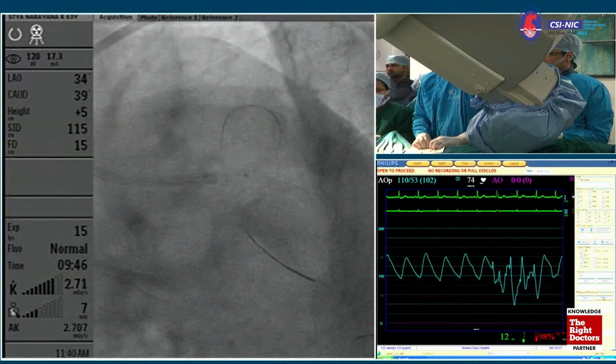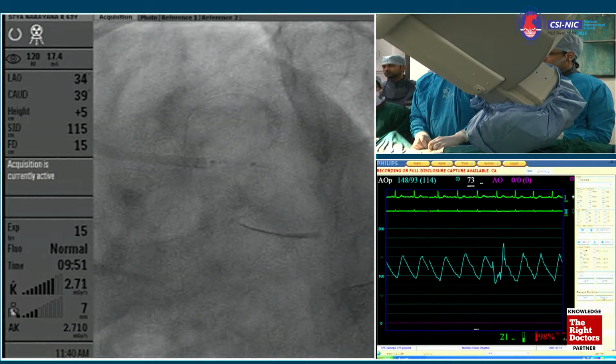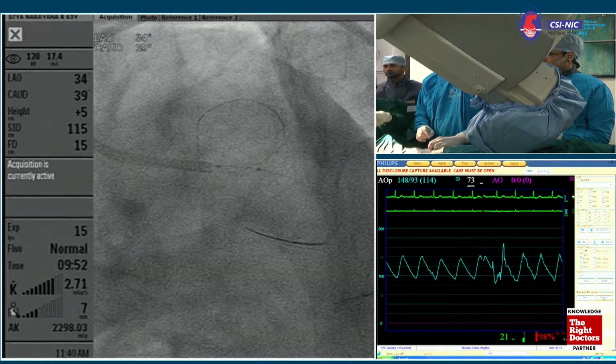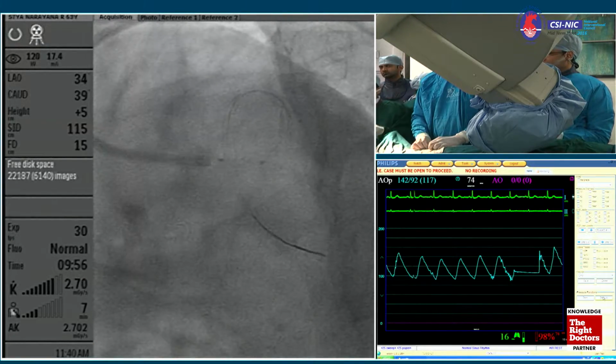Can I just quickly see the position of the balloon? Right, you got 4 minutes time by the time we just switch over to the other injection lab. A little bit. Yeah, which is fine. Just inject. Christoph, I think we're good here. Christoph, go up, go up.